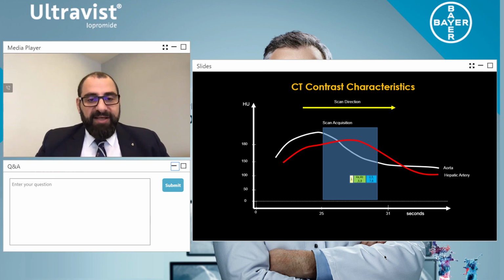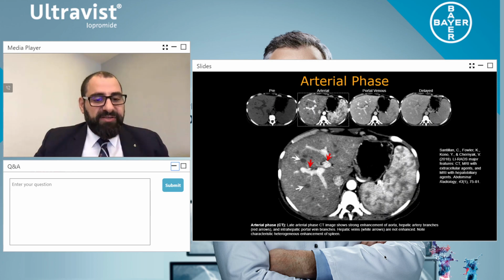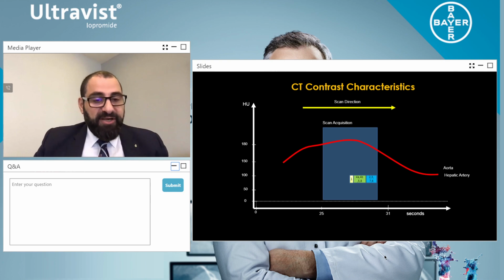Now, I've just had another question, and I think this is a really important question by, I'm sorry if I've said your name wrong, Gangaparappa. Can we mix different iodine concentrations in the same manufacturer's syringe? I would not recommend this at all. I'll tell you why.